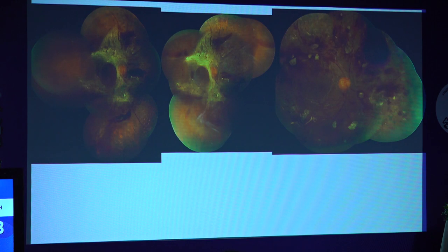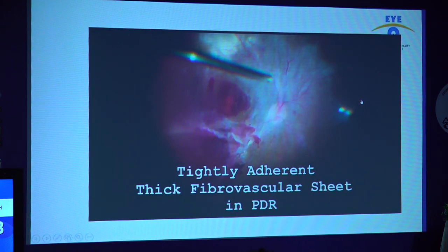Now, these things are a little different from our conventional PDR surgeries when we were operating them at the later stages, when we were doing heavy PRP, and neovascularization used to regress. Here, we are operating on neovascularizations which are still active. So even when you have done your surgeries, they will keep on regressing in the post-operative period and increase the traction. So that's why probably ILM peeling and creating the smaller islands is good enough. And my colleague, I'll show you a few pictures at the end of the presentation.